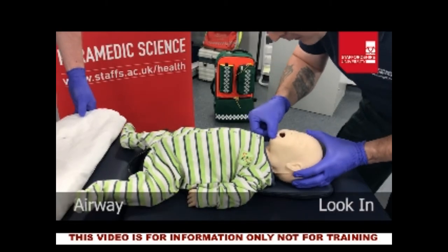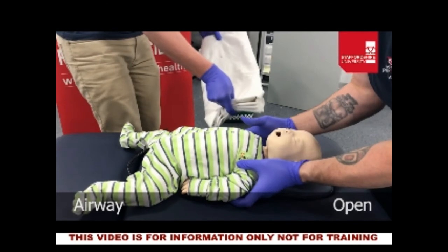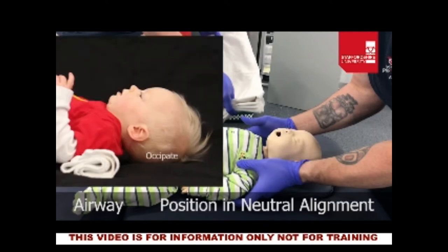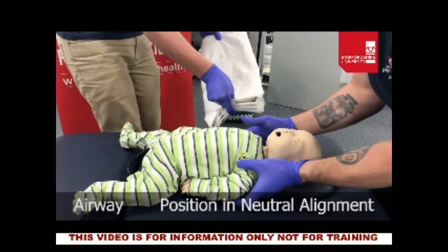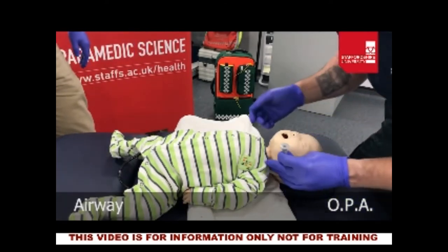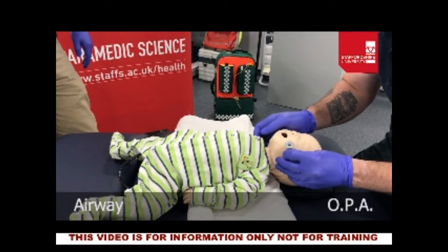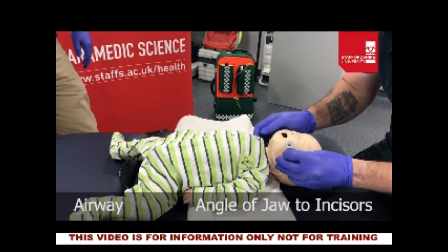Now we are going to look in the patient's airway and check for any foreign body obstruction, and we need to open the airway considering patient positioning. Because of the child's age, their occiput is proportionally much larger relative to their body, which takes the airway out of alignment. To bring the airway back into alignment, we are going to place something under the patient's shoulders. We then size up and place an oropharyngeal airway or OPA, sizing it from the angle of the jaw to the level of the incisors or gums depending on the patient's age.